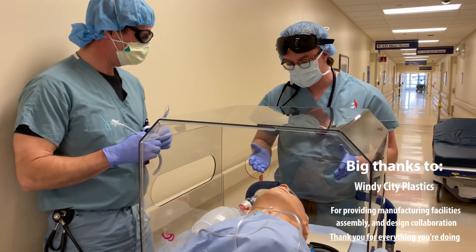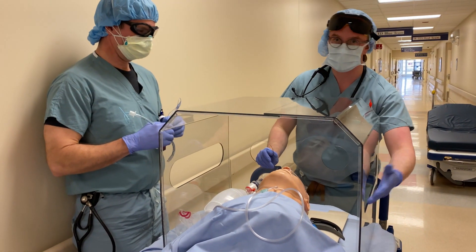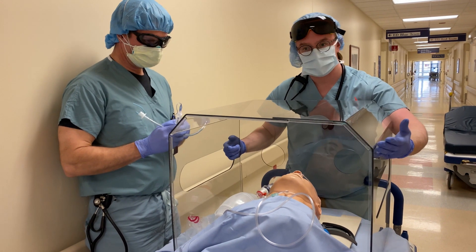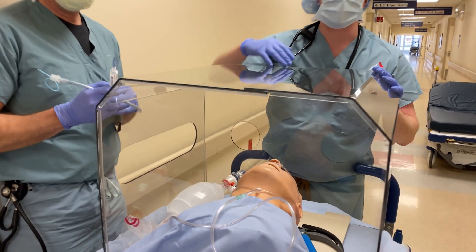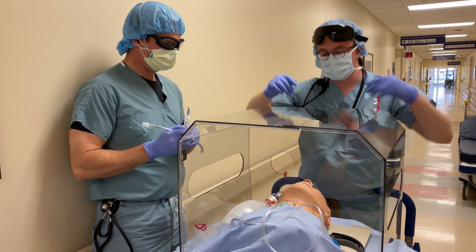This particular model has two holes for intubation, protects you from the back, and then side ports for respiratory and whoever's assisting you with the intubation. It still has access for chest compressions, and on the front you have a ridge where you can clip surgical drapes so people can do chest compressions if needed, and the rest of the room isn't getting exposed as you're aerosolizing everything out this way.